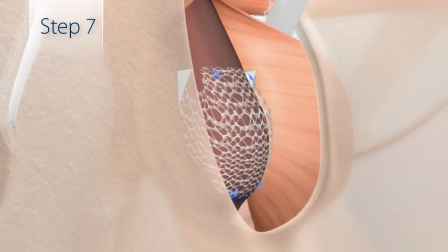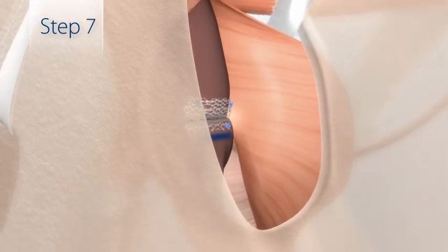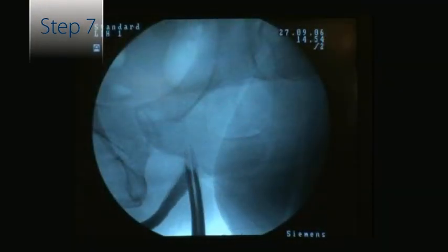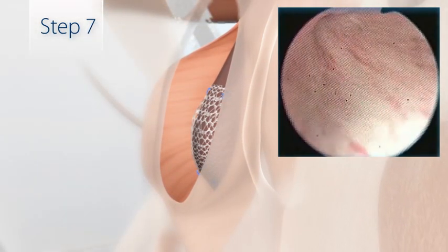The sling is then pulled tight to reposition the urethra. There will be approximately 2 to 4 centimeters proximal movement of the urethra. The motion is parallel to the posterior urethra, repositioning the urethral lumen rather than obstructing it. Flexible cystoscopy is recommended at this time to confirm proper sling positioning as shown here.